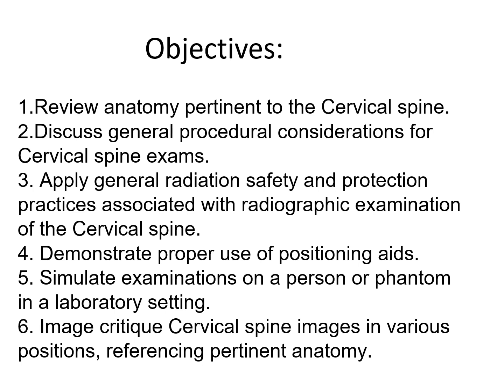Proper use of positioning aids. You might be using 45-degree angle sponges for any table examinations. You should be using the table bucky and not tabletop. The exception to that rule would be trauma cervical obliques, which I'll teach you how to do.